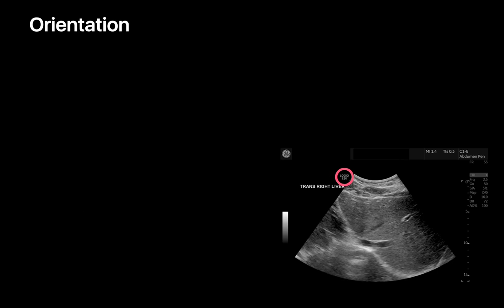If someone were to view your ultrasound image later in the day and hadn't been in the room watching how you had held the probe, they might have no way of knowing that you had held the ultrasound probe backwards. If they assumed you held the probe the other way, they could make right versus left errors.